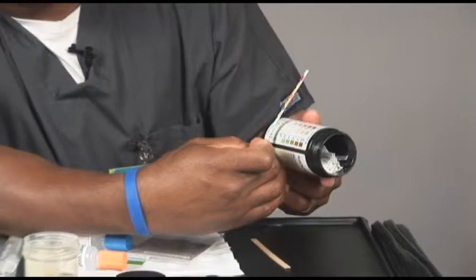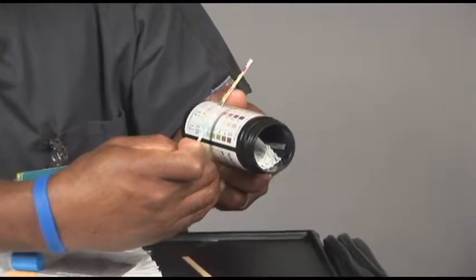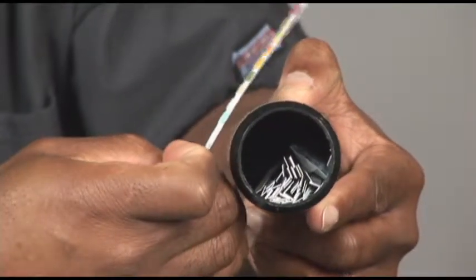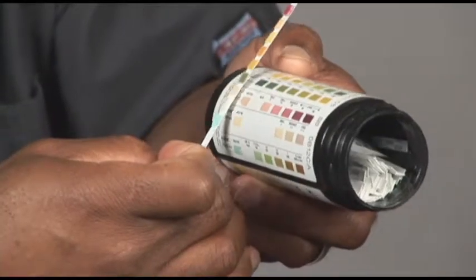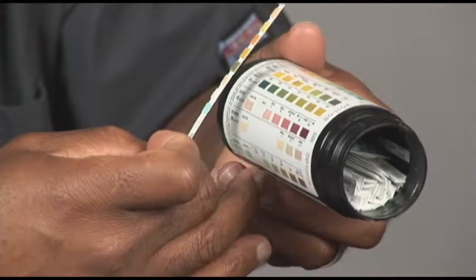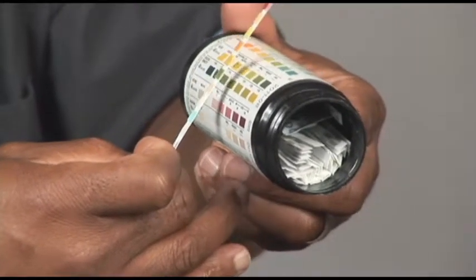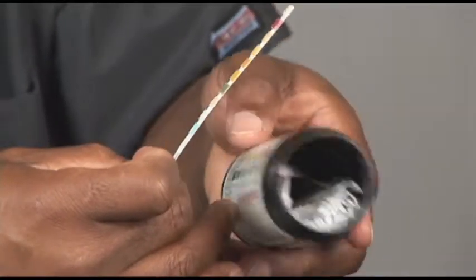Next is the bilirubin, same thing. This one waits about 30 seconds. Go across and you would record the corresponding. This one goes from small, moderate to large. Ketones, which is the third one up, same thing. Just go across. Specific gravity, which is 45 seconds. You're just scanning across. All the way up, you would do that all the way up to leukocytes.